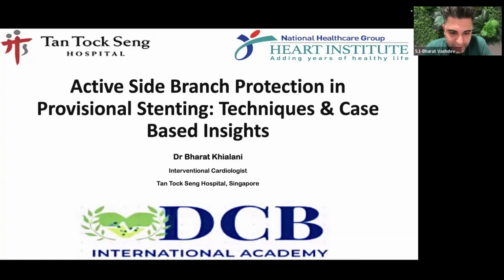I've done a little reading about it, and she suggested we do this presentation so we can have a discussion. I can show you some cases and some evidence of why I think it's a good technique to learn to help simplify bifurcation PCI with a provisional strategy. The idea is to be as interactive as possible, so I'm happy to be interrupted at any time. I've kept it nice and short so that we have time for discussion as we go through the slides.